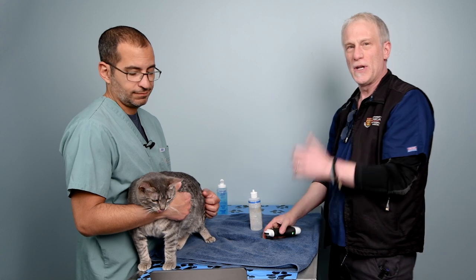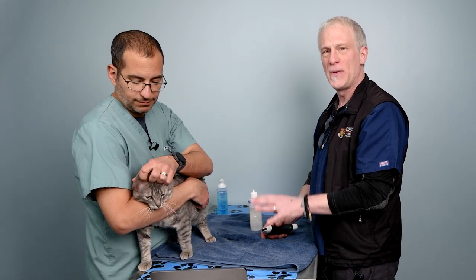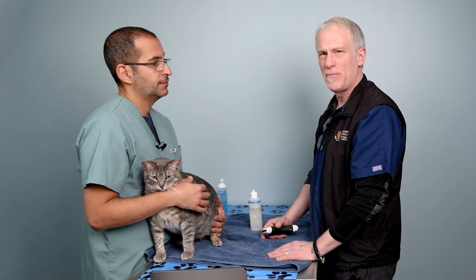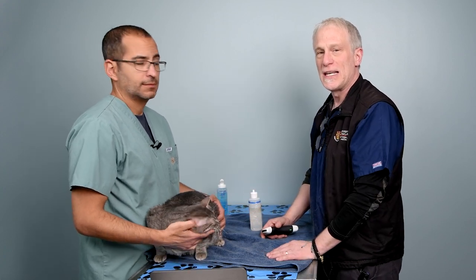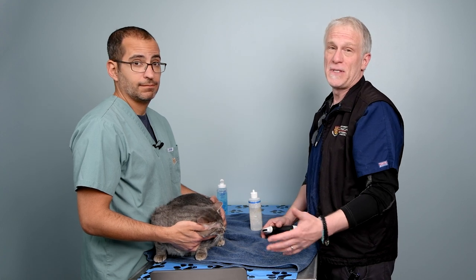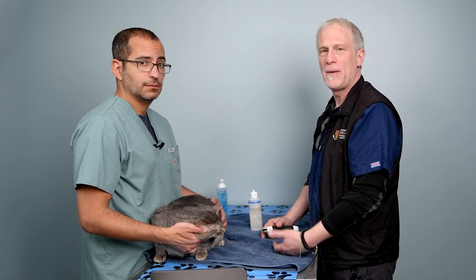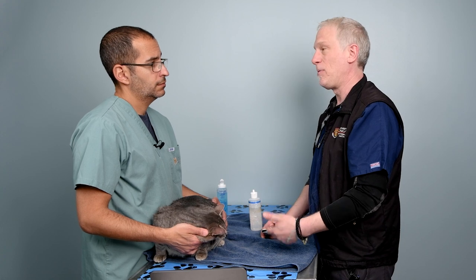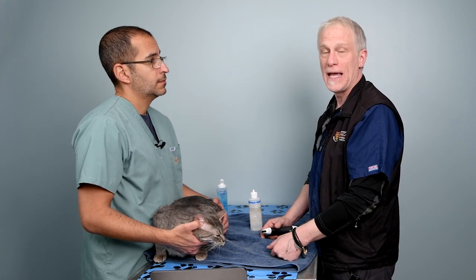So that was a quick overview — we can usually do it in about 60 seconds. We can scan for pneumothorax, scan the lung surface for B-lines and consolidations, find that pericardio-diaphragmatic window to differentiate pleural from pericardial effusion, turn the probe parallel and scan the ventral pleural and lung borders by alternating in those intercostal spaces. Don't forget the subxiphoid, as shown earlier in the abdominal station — it gives a really nice window to assess the heart in contact with the diaphragm in feline patients, as well as the caudal lung region and pleural space. Don't forget the subxiphoid as part of your PLUS scanning.